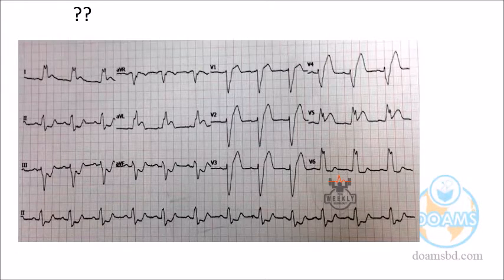What we usually do is talk to the patient about any symptoms. Sometimes we do the ECG only for a routine checkup, and the patient does not have any disease. Maybe rarely, in my experience also, a patient does not have any problem, but a wide QRS is there, seeming to be left bundle branch block. In this situation, we are not worried. But if the patient has chest pain or a predisposition for heart disease, and we see left bundle branch block appearance in the ECG, it is better to refer the case to the specialist.